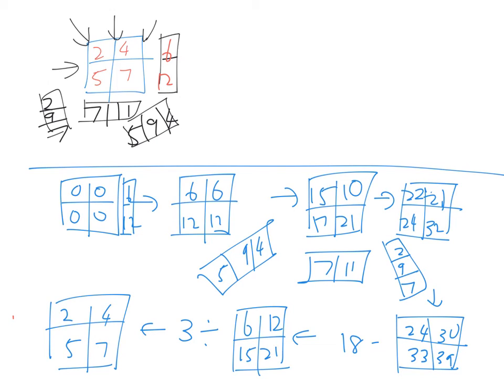So what will happen is, you will get the image of one slice. Then you're going to repeat for the other slices. So can you imagine how many x-rays you're taking? For one slice in this example, you're already taking 4 x-rays. The next slice, another 4 x-rays. The next slice, another 4 x-rays. So if you take like 20, 30 slices, do you know how many x-rays you're going to get? That's why the radiation dosage that you experience during a CT scan is equivalent to a few hundred x-rays.